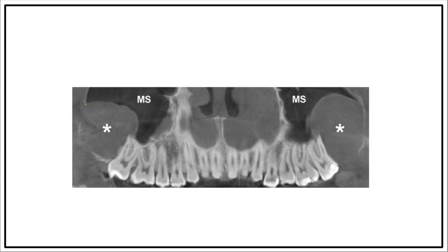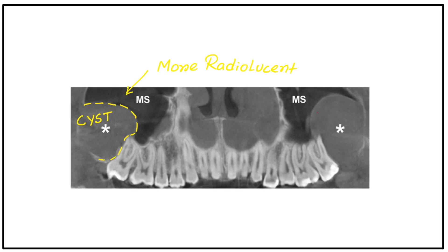Our first concept is how to differentiate a cyst and maxillary sinus when they are in close proximity. Cysts contain fluid and the maxillary sinus usually contains air, so on radiograph the maxillary sinus appears more radiolucent than cysts. Here in this panoramic CBCT image, you can see bilateral odontogenic keratocyst. This is the maxillary sinus — you can easily appreciate that the maxillary sinus is more radiolucent than the cyst.